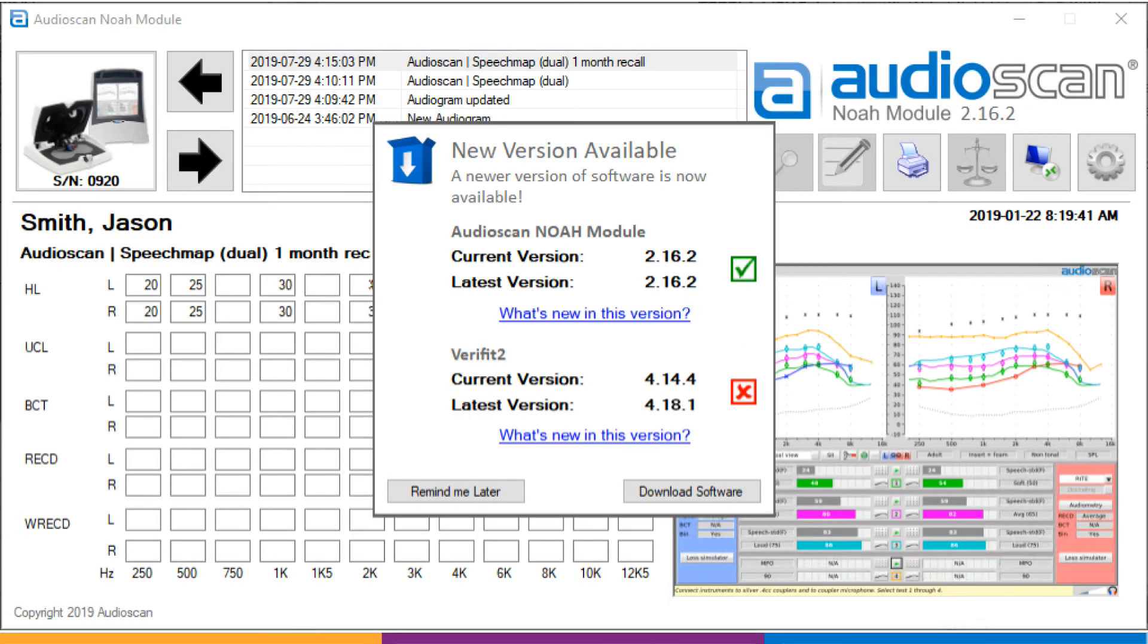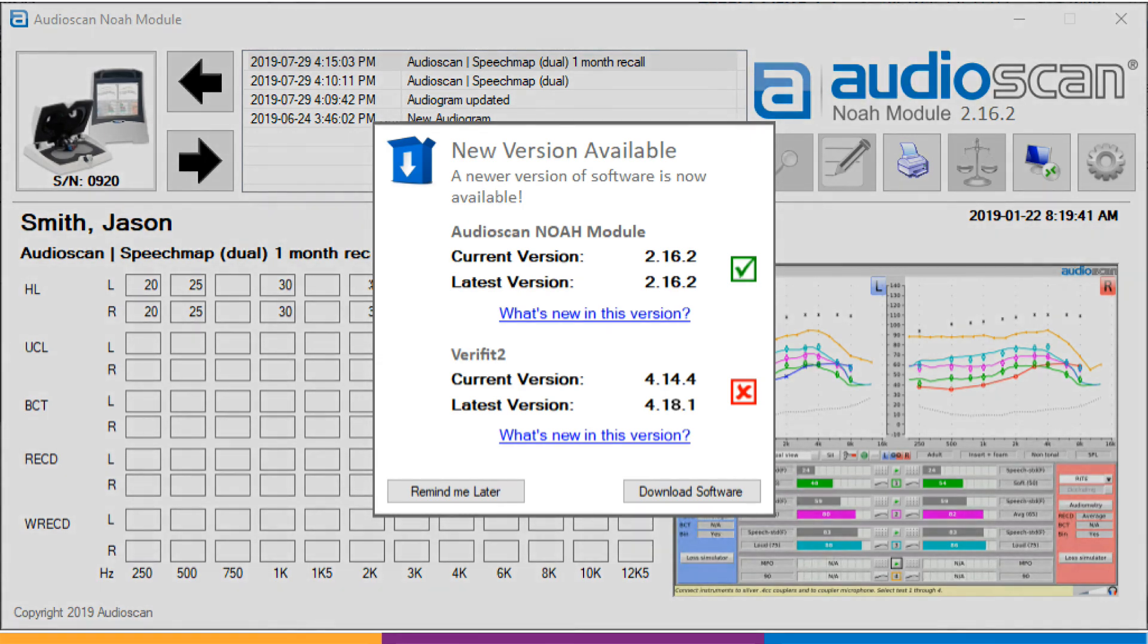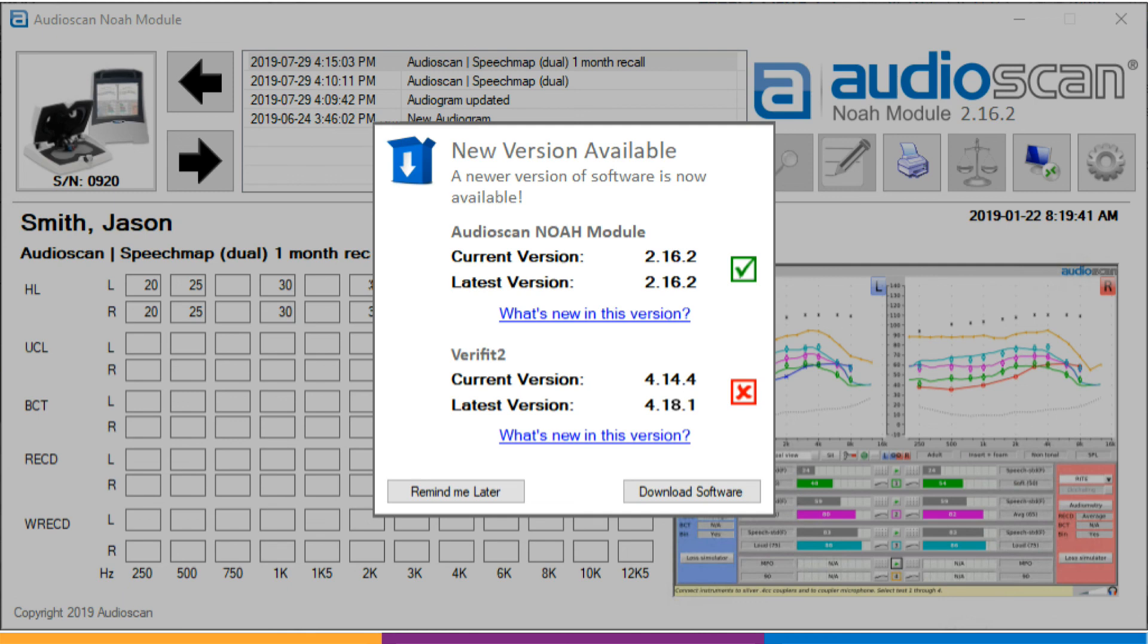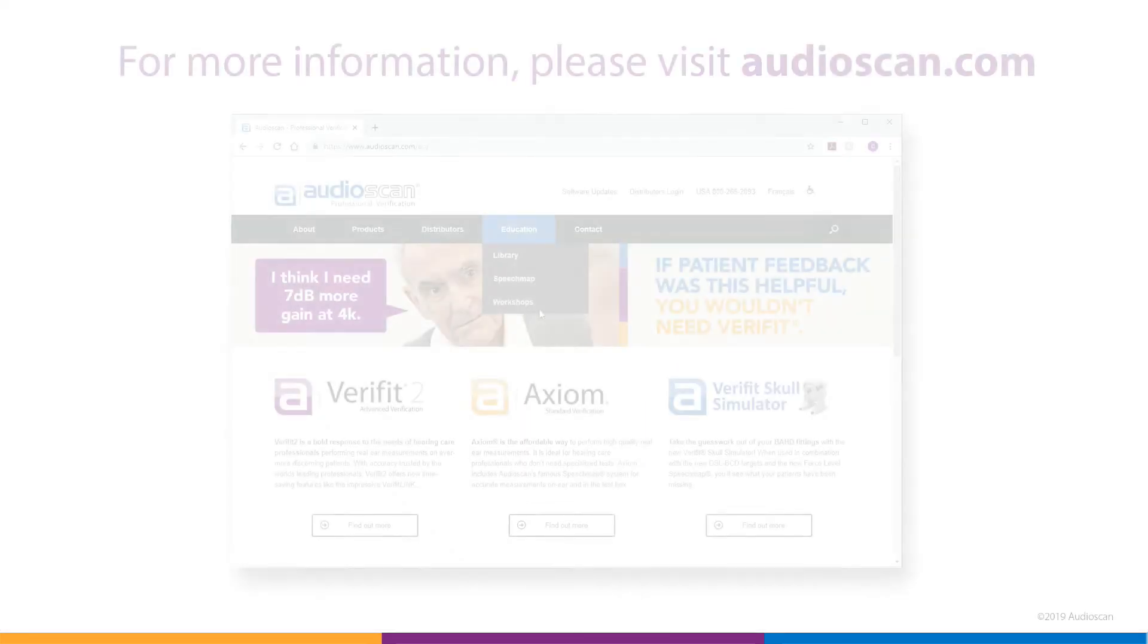One last feature is again for users of the AudioScan Noah module. Upon launch, the module will now notify you of any possible software updates to either your AudioScan equipment or to the module itself. We know how busy you are. This way you won't miss new features as they're released. If you aren't ready to update, you can pause or cancel these reminders in the settings menu.